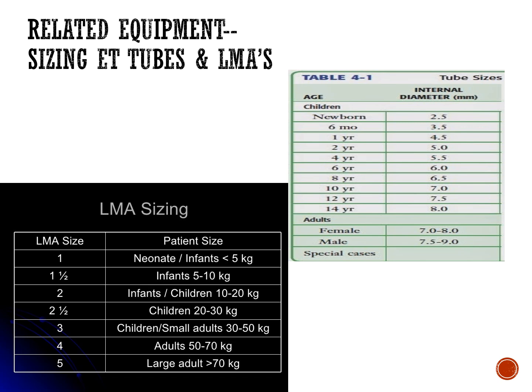The other thing you may want to focus on is if you work at a facility that uses subglottic tubes, because the subglottic tubing occupies space on the outside of the endotracheal tube.